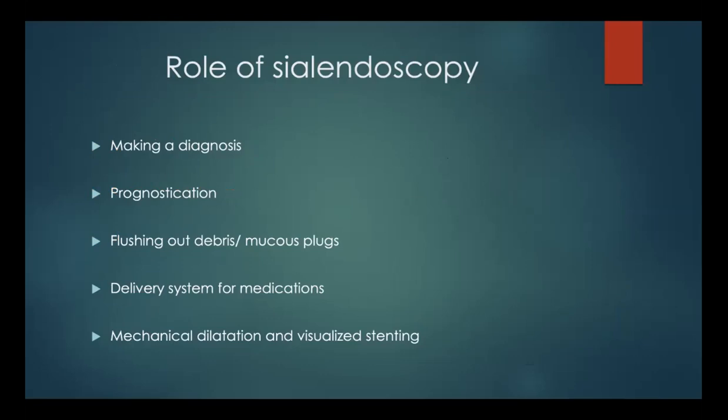Apart from that, in the treatment aspect, it's a good tool to flush out any mucus plugs or debris which are present deep inside the gland, which can act as a nidus for infection. It is a delivery system for medications like steroids. And of course, last but definitely not least, we have the mechanical dilatation effect of the endoscope itself, and we can stent under visualization.